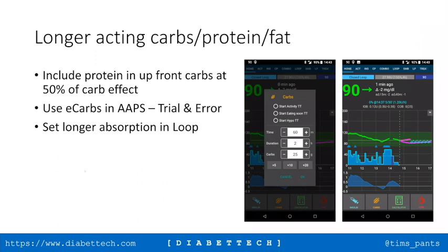Hi, Tim. Can I just ask, we're on objective 10 at the moment, and we've just tried starting to use SMBs. And I've read the docs and I've searched the groups and asked lots of questions, and we're just really struggling. One of the things that's been suggested to us is to use the bolus calculator, to enter all of the carbs up front for the meal, but then use the minus button to only bolus for, say, half of the carbs. Yeah. But finding is that then.